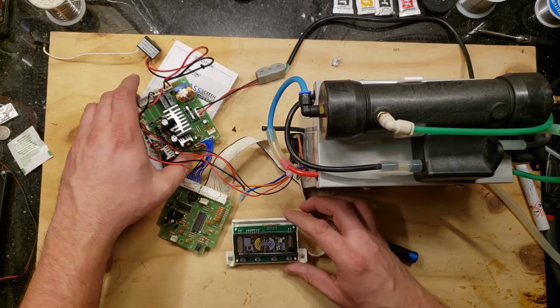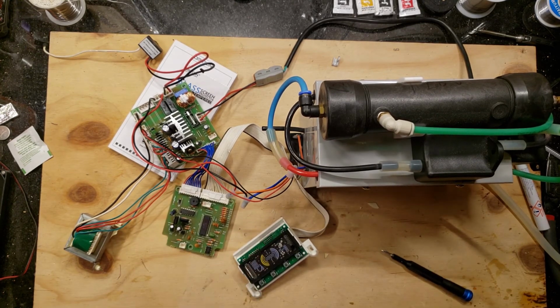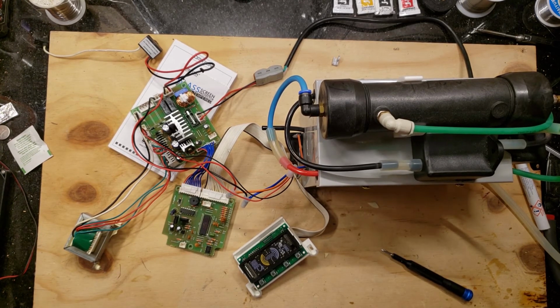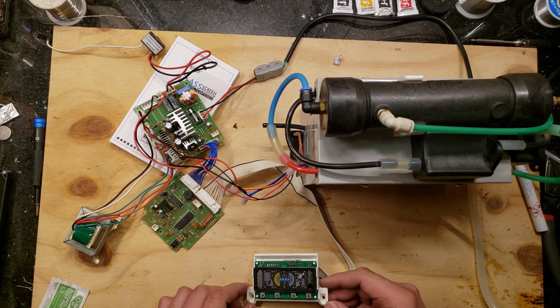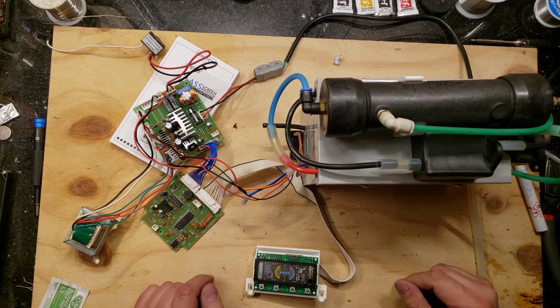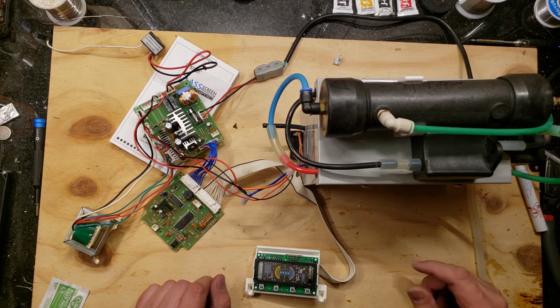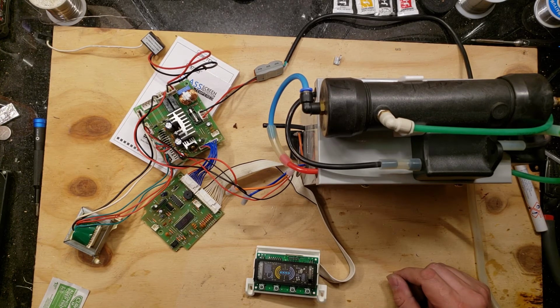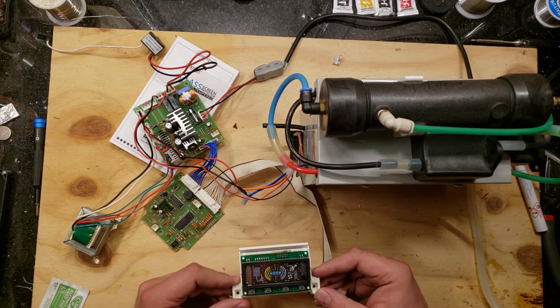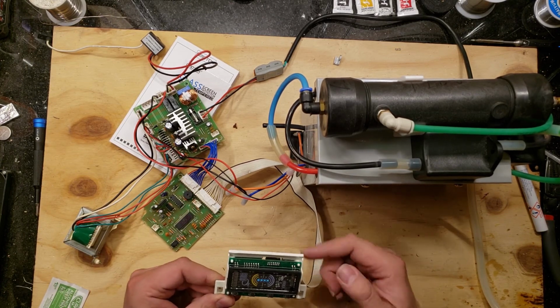All right, so let's see. Should I try to option that other resistor? See if it makes any difference. So unfortunately, I did not find another 2.2K resistor. All of the resistors I'm coming across in my stash are like 22 to 150 ohms because I mostly work with LEDs and stuff. I will probably not be using this control system to power this up. I think I'm just going to have a simple power supply.